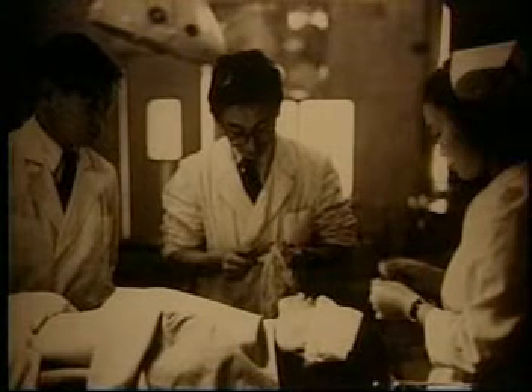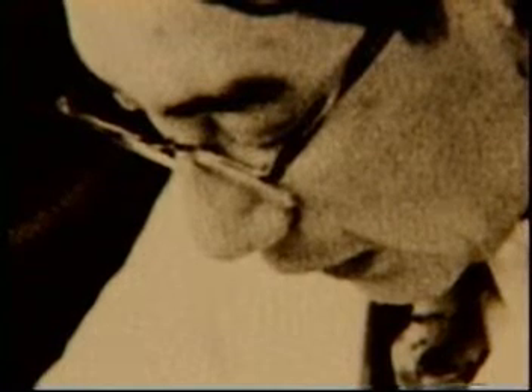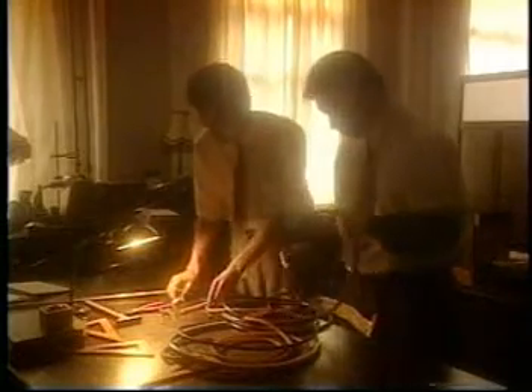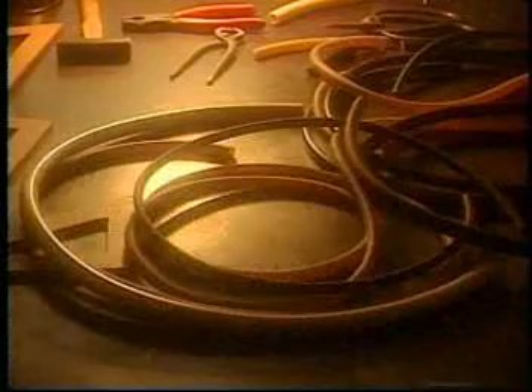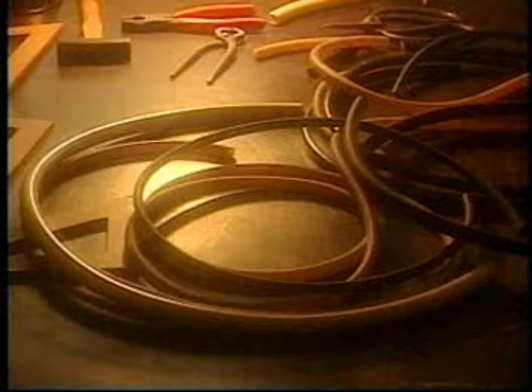Meanwhile, Dr. Uji continued to attend to his cancer patients, to whom he could no longer offer much hope. The delay in the development of the gastro camera was causing him a great deal of anxiety. Mr. Sugaura and Sugaumi, witnessing Dr. Uji's frustration, decided not to wait any longer, and to use all of the pieces assembled so far in order to make the prototype as soon as possible. To avoid any organ damage, they decided to gather all of the components in a soft vinyl tube, instead of a metallic tube.